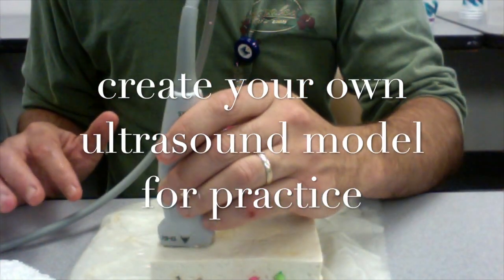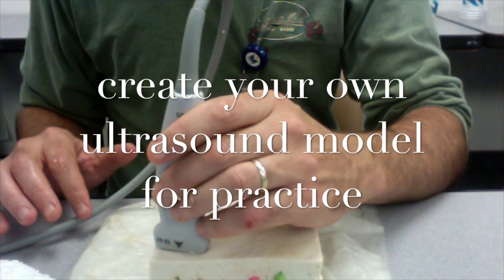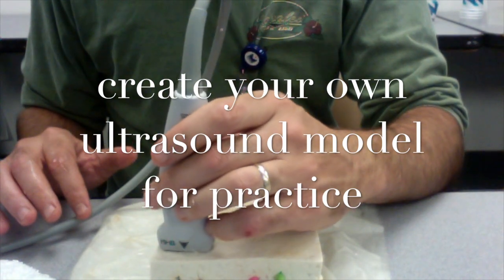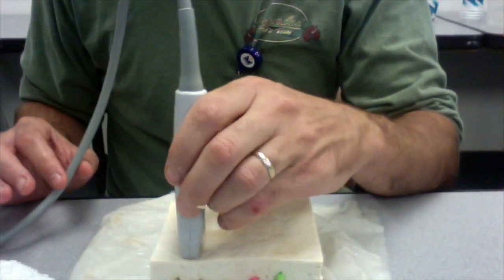Hey, I'm Dr. Gordon Johnson from Portland, Oregon, and I'm going to teach you how to make a model where you can practice ultrasound scanning for IVs, abscesses, foreign bodies, and placing lines for super cheap.